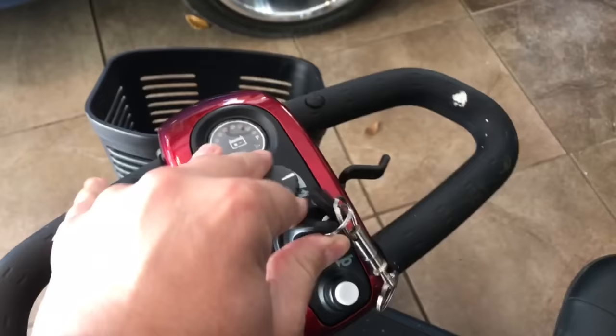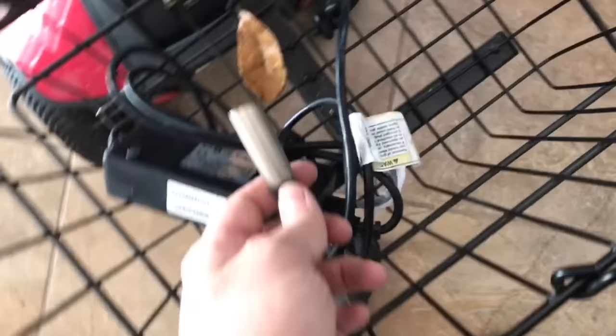This is going to be a short video on what to do when you turn on your scooter and you have no power at all. These scooters — this is a GoGo, not sure the model, by Pride Mobility. These things charge through an XLR cable, which is similar to a microphone jack.